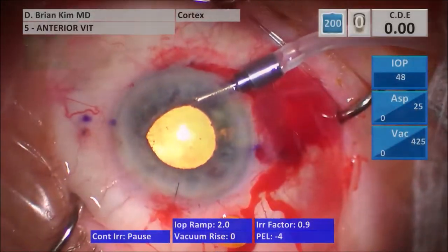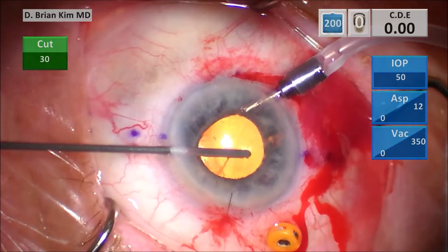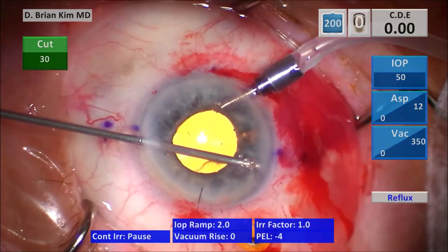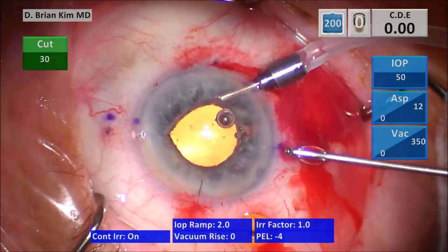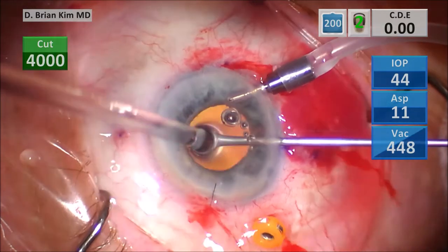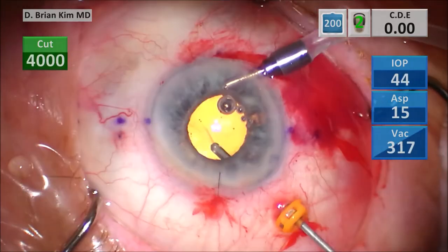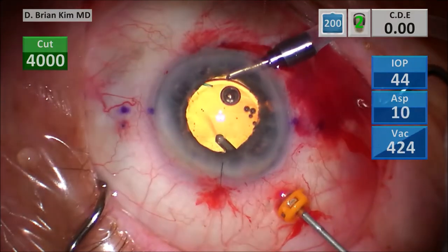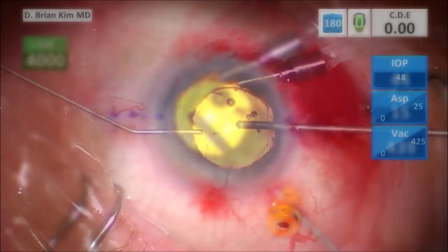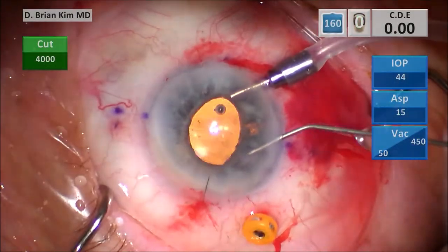This is peripheral iridectomy time — I switch the setting to a lower cut rate and high vacuum so you can cut very slowly and create a small iridectomy. I switch to anterior vitrectomy — the pupil is a little peaked, so there was some vitreous there. I got that vitreous on the left side and continue some more vitrectomy. Since this patient didn't have a complete vitrectomy, it's really important to make sure you have a thorough anterior vitrectomy. I'm inspecting, making sure there's no vitreous, and inject some intracameral triamcinolone as well — some Kenalog.